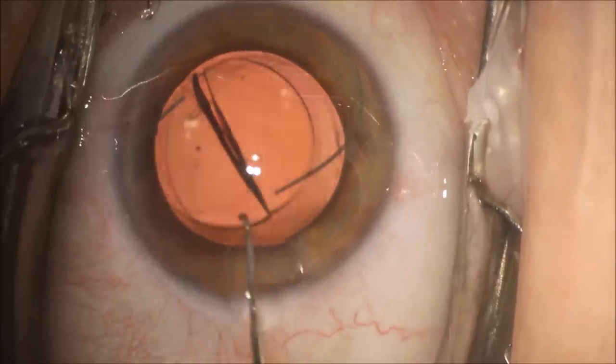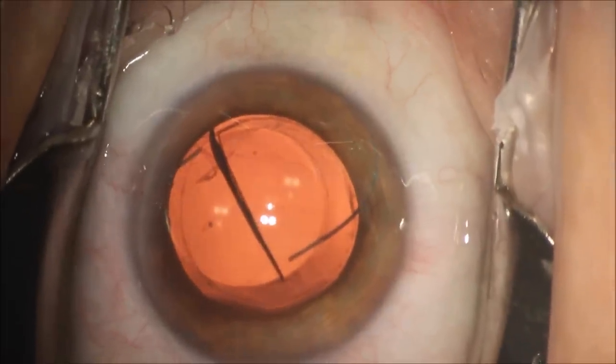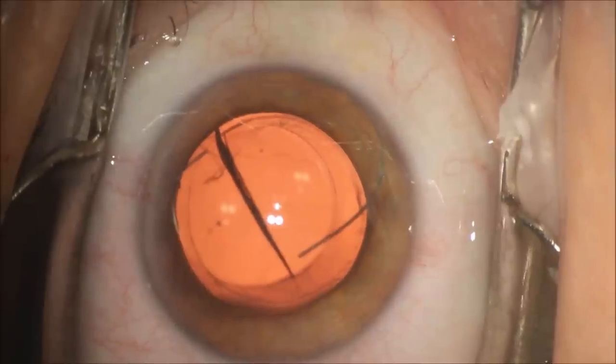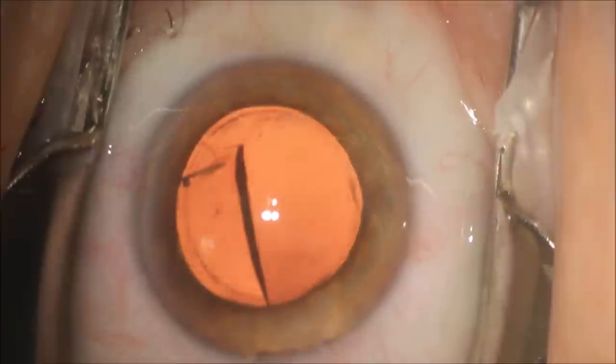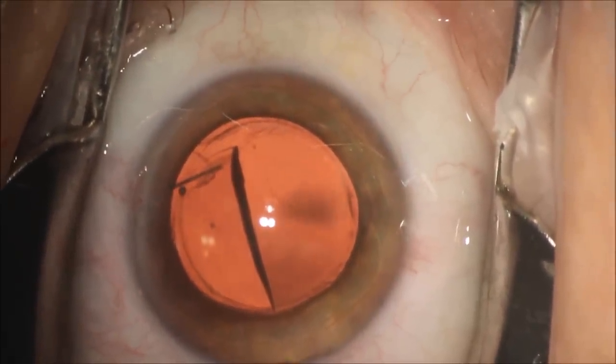We are going to position this lens half so that it is easily accessible with the intraocular forceps. We use a micro forceps here to remove the lens piece. You can see we hook it around the optic of the lens and then just draw the lens half through the clear cornea incision very smoothly without any difficulty.